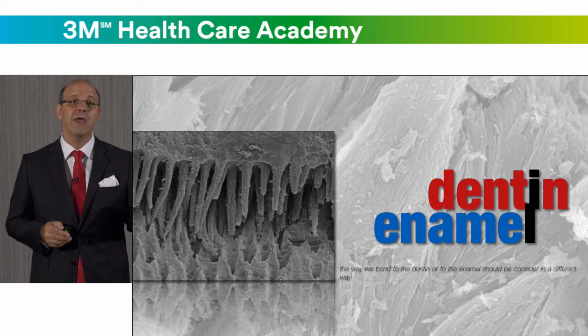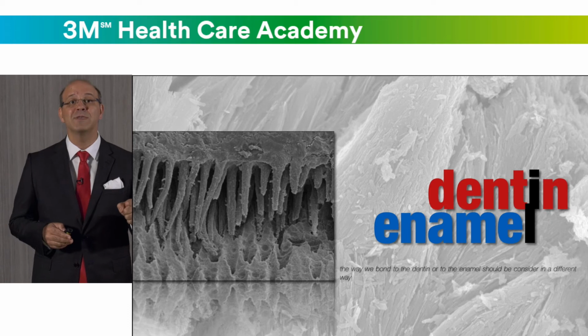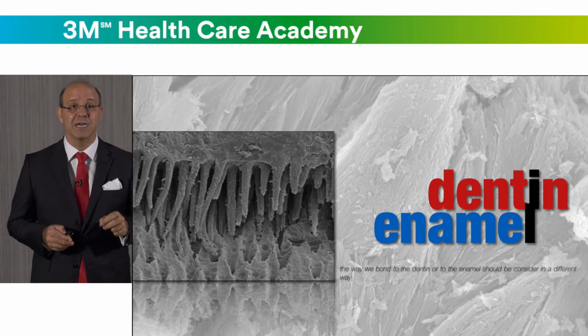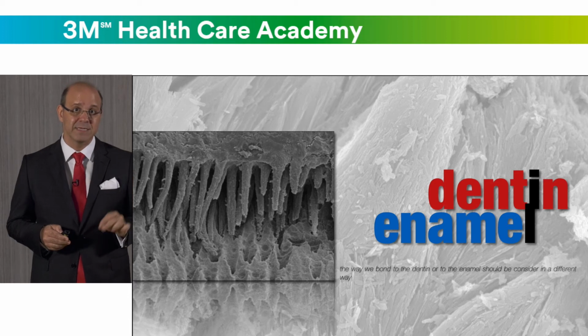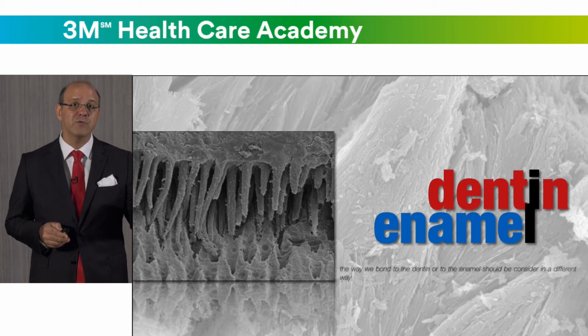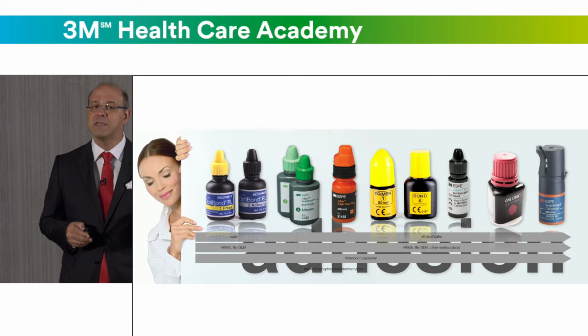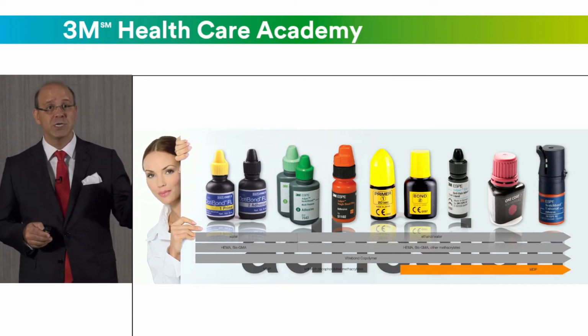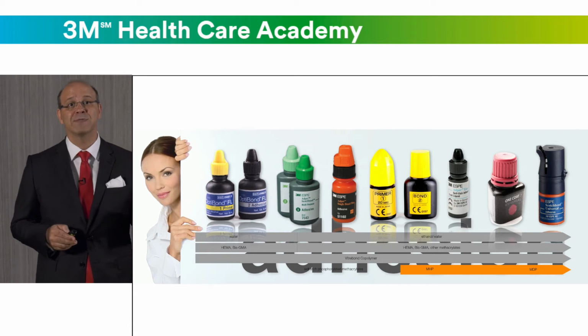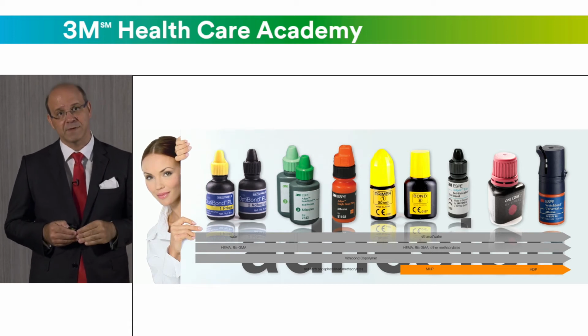So when we have enamel, no matter what kind of adhesive we have, you should always do selective enamel etching. It means that when we have enamel, we have to etch the enamel. Dentin is different. Nowadays we have a lot of different adhesive systems, from the 3-step total etch to the 2-step total etch, 2-step self-etch, and universal adhesives.